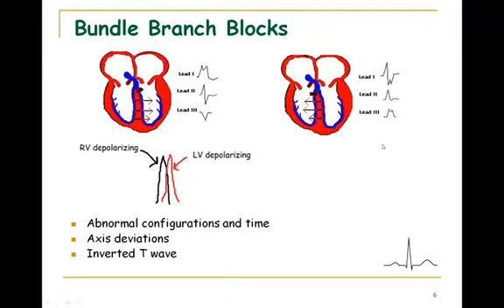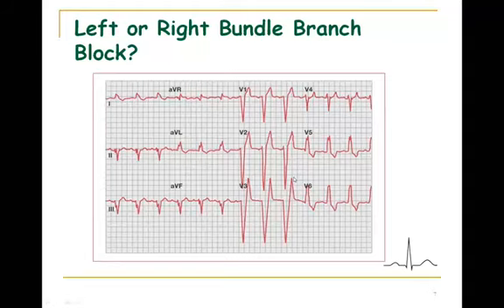You will also notice with the left and right bundle branch blocks that what you see in the standard limb leads is a little bit different, but I don't want you to have to memorize that. Sometimes, if you look at your standard limb leads, it's difficult to even notice that they look bizarre. It just doesn't stand out as much. You'll say, oh, they may look prolonged. Most people don't just run standard limb leads. You usually run a 12-lead ECG.